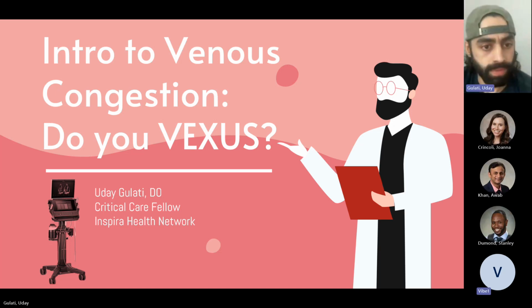All right, hey guys. So this is a repeat lecture from the beginning of last year, but I know a lot of the first years were requesting it, and some of the second years wanted me to go over it again. So it's basically an intro to venous congestion. It can obviously go into a lot more complexity, and the fun part about doing all this is obviously hands-on training, which we will try and get either in person or at a small focus section at some point in the next few weeks.